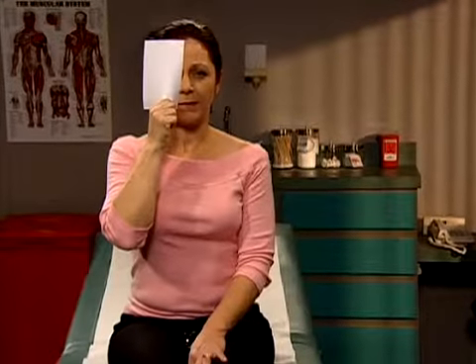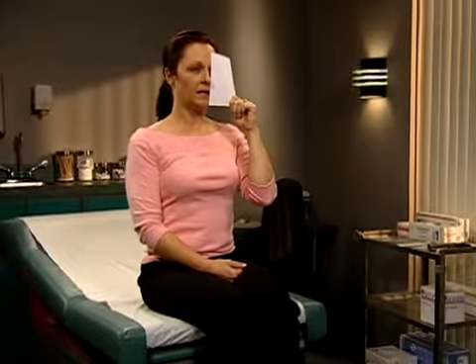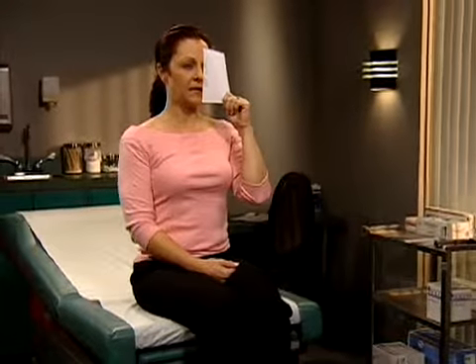PECFD. Can you read anything on line 6? Maybe, but the letters aren't clear. Okay, now cover your left eye with the card and tell me which line you can read clearly. Line 5 again. Can you read that line backwards? DFCEP. Now we'll do this again.